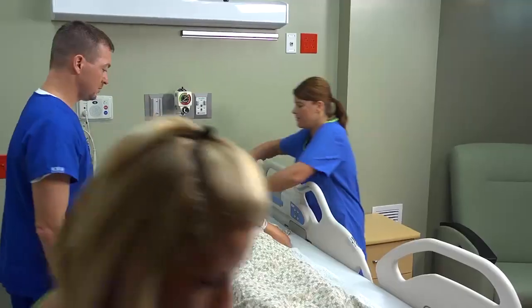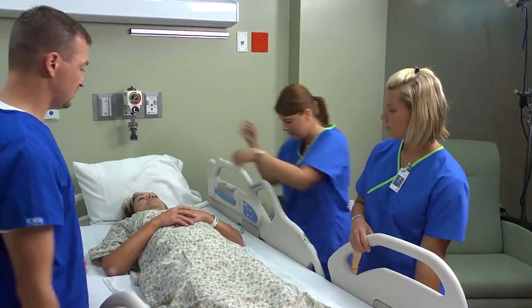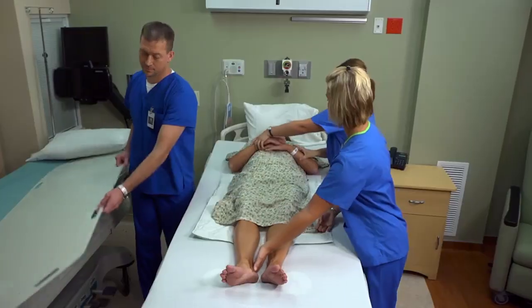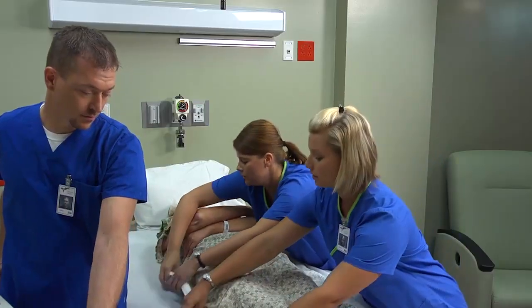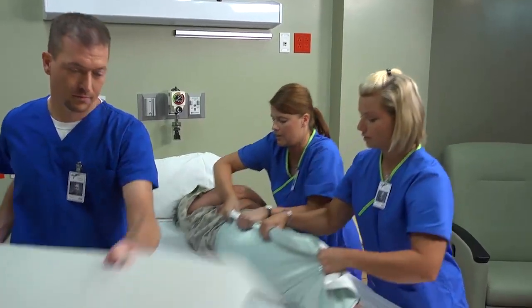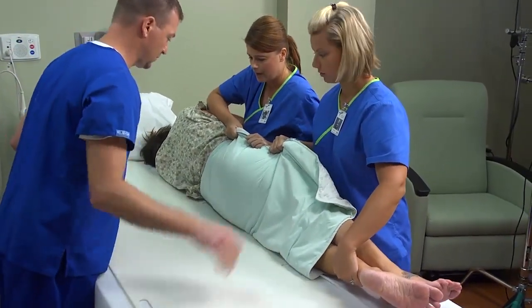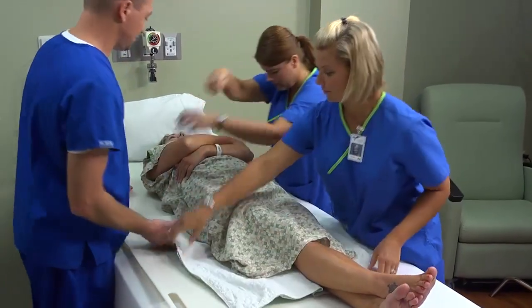Support the patient's head while you remove the pillow. Next, lower the side rails on the bed. Then cross the patient's arms over her chest and help her cross her ankles. On the count of 3, we're going to roll you towards us. 1, 2, 3. On the count of 3, turn the patient onto her side toward the 2 assistants, moving her as a unit in a smooth, continuous motion.